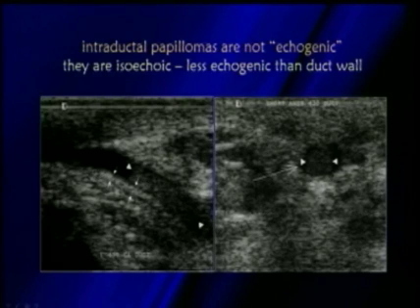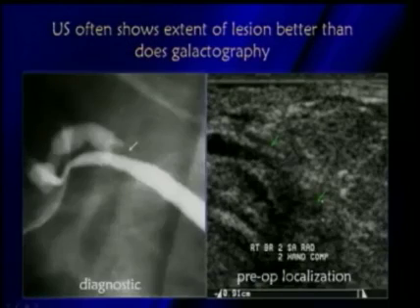This is long axis view. Here is also a short axis view showing you the echogenic wall and the isoechoic papilloma.